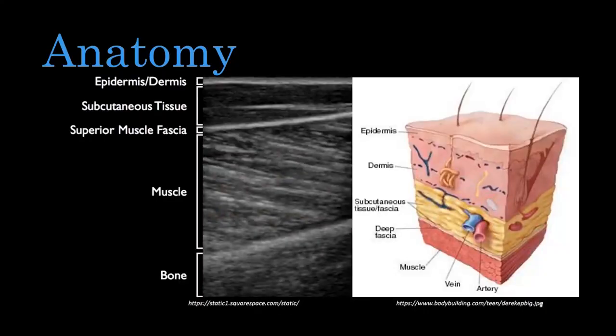As with any image acquisition, understanding the anatomical structures is important to your exam. Note the organized pattern of the epidermal, dermal, single echogenic bright layer on the image to the left. Now, also note that there's subcutaneous tissue directly underneath that, and that's hypoechoic. You get these thicknesses of layers that vary depending on the region of the body and the habitus. And when you get deeper, you find structures that you want to avoid, including the muscle, the tendons, and the blood vessels as well. Blood vessels tend to be anechoic, linear, or circular structures. And then deep to that, you can find bones that have a bright, echogenic cortex with posterior shadowing.